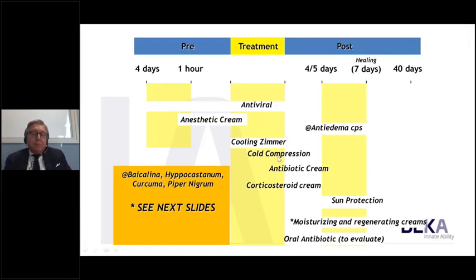What is important to apply is cold saline gauzes immediately after the procedure, fractional or freehand. Then we use antibiotic cream in the first 4 or 5 days, and then it's very important to use any kind of moisturizers and regenerating cream.